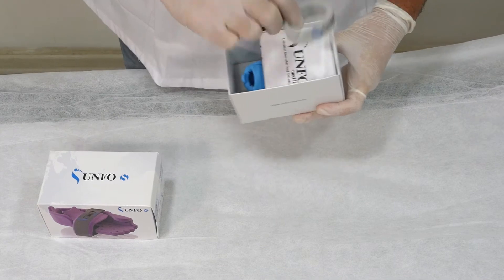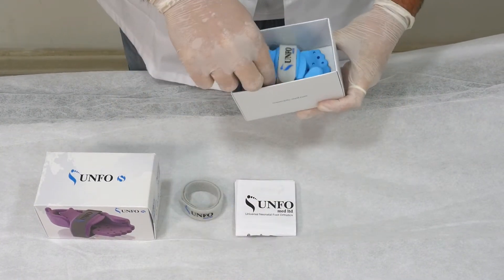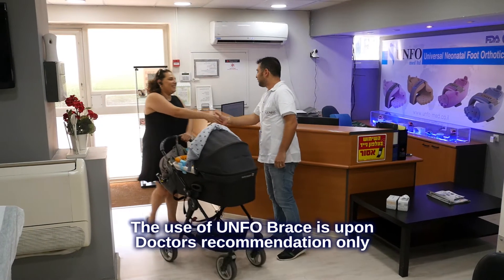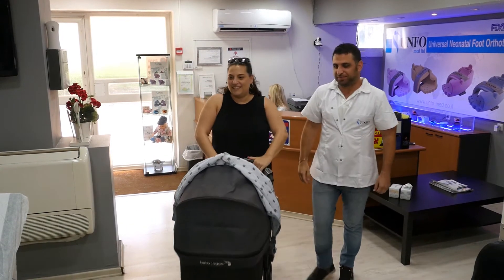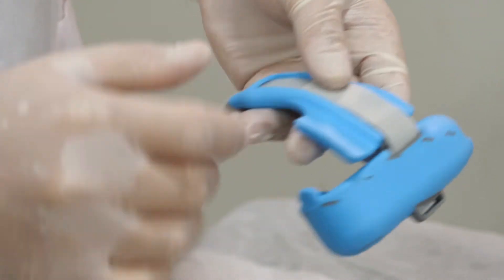The Unfoe box contains an additional strap, a user manual, and the Unfoe brace. The use of the Unfoe brace is upon doctor's recommendation only. The Unfoe brace consists of three parts: the brace's body, the cushion, and the strap.